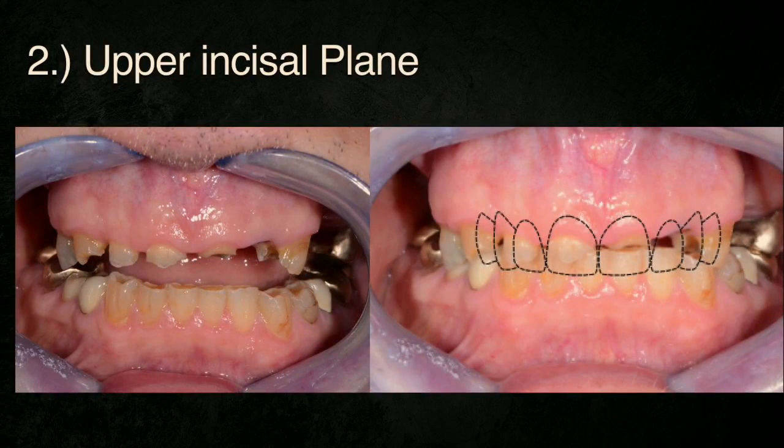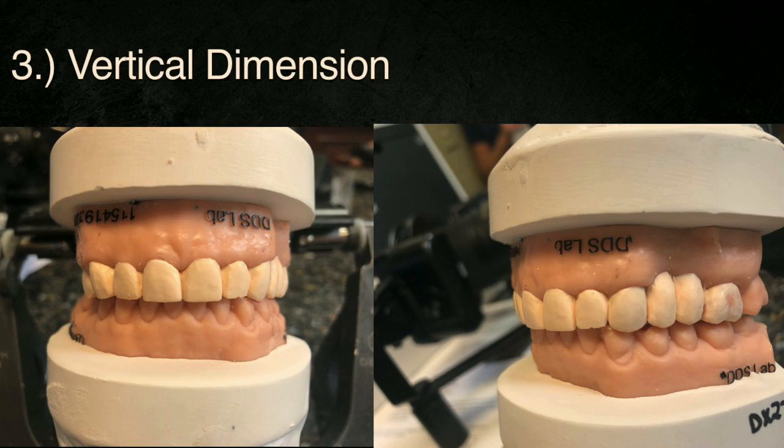And then we're going to figure out that upper incisal plane, and you can see I'm visualizing a little change incisally, but a lot of change gingivally. I potem wyrysowaliśmy obrys zębów górnych, gdzie one się powinny znajdować w optymalnej pozycji. Widzimy, że trochę na zębach można uzyskać długości, ale duże zmiany będą w obszarze dziąsłowym. Now we're going to take this and basically wax those things on the articulator. Następnie nawoskowaliśmy te docelowe pozycje zębów i osadziliśmy to w modelach w artykulatorze.